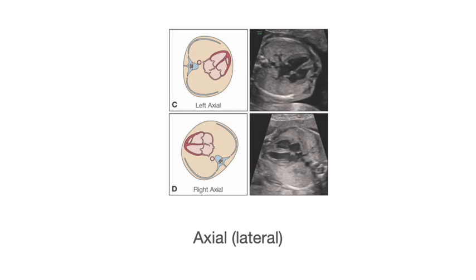Now, the other ways you can approach it is from the sides, so a lateral view, or an axial view of the heart. And really, I'm not sure this picture is great, but really the axial or lateral view should be perpendicular to the septum. The bottom one is, the top one not as much.